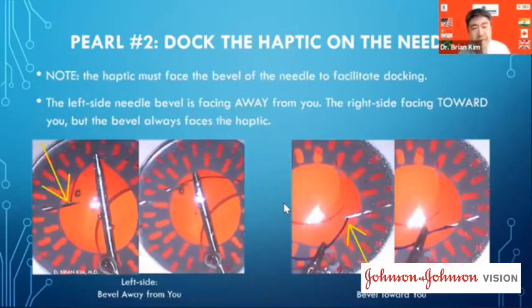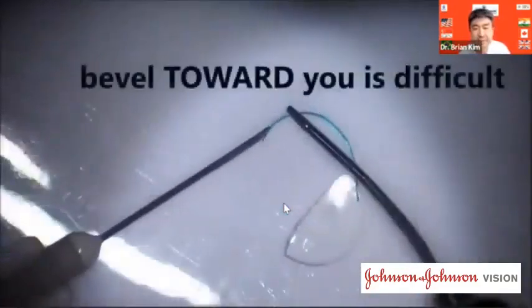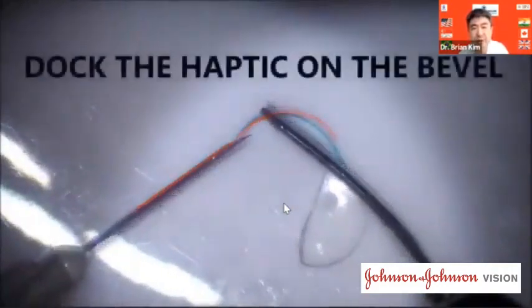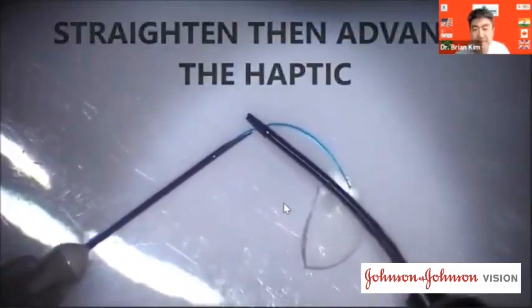In this case, the left side needle, the bevel is facing away from you, and the right side bevel is facing toward you, but the bevel is always facing the haptic. And this is illustrated here. It's difficult to thread when the bevel is not in the correct position. That's because the needle is straight and the haptic is curved. Dock the haptic on the bevel of the needle, flatten it out, and then advance the haptic.